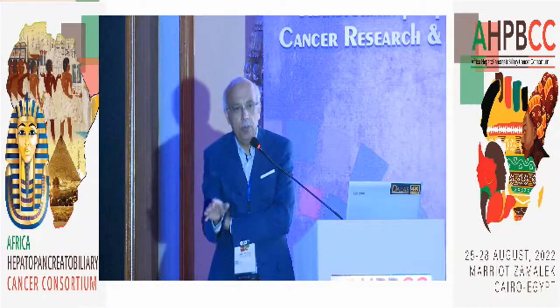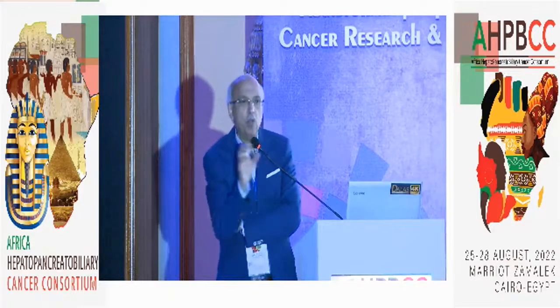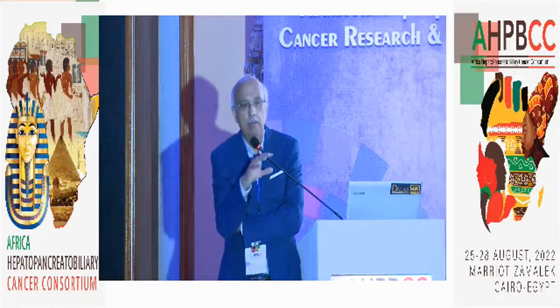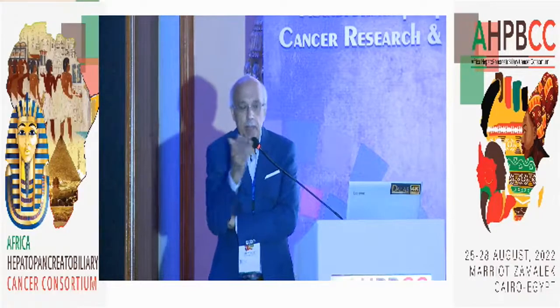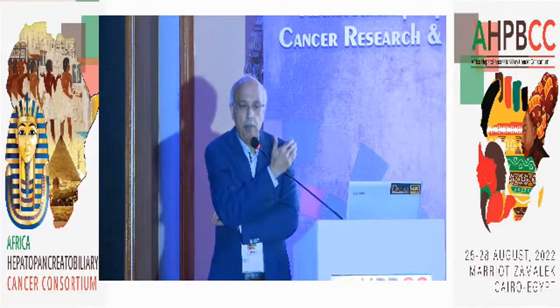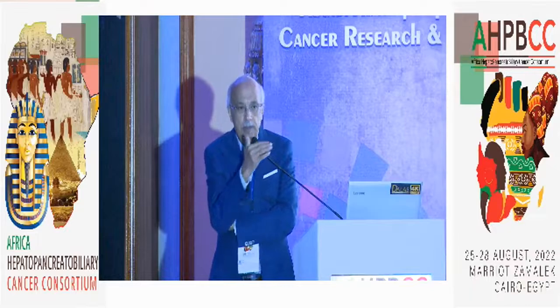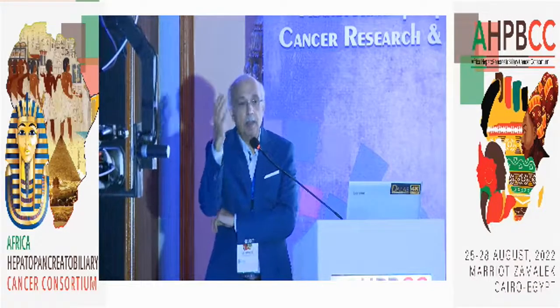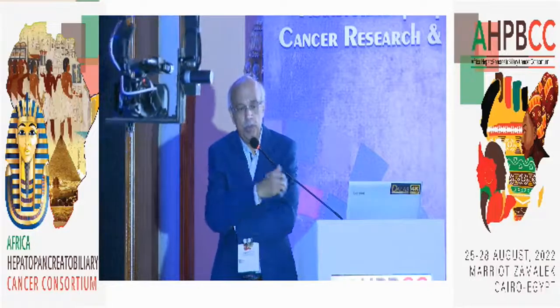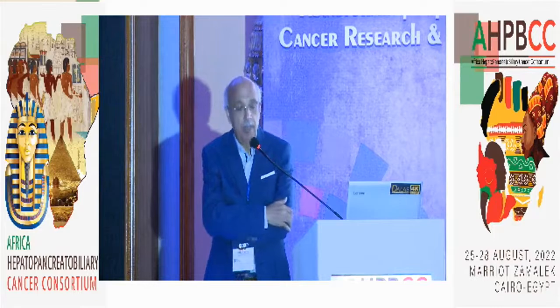At this moment, we may apply the shear wave machine to get the F score of this liver and have whole data about the liver of the patient: the focal lesion plus the liver status from F0 to F4. And even F4 starts from 12 kilopascal up to 75 kilopascal. All these are important information about the liver status of the patient. Thank you for your question.